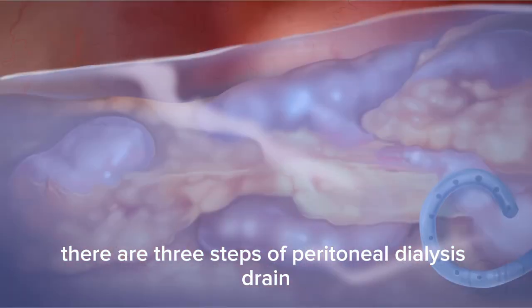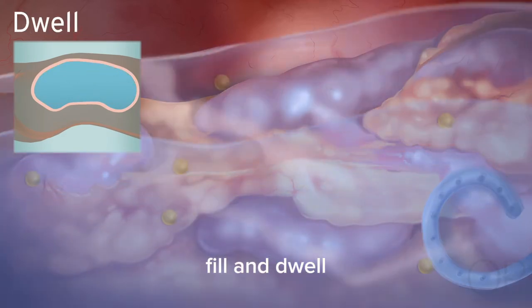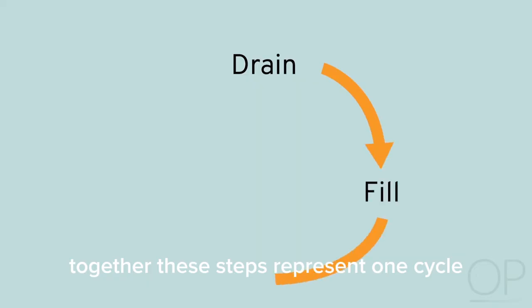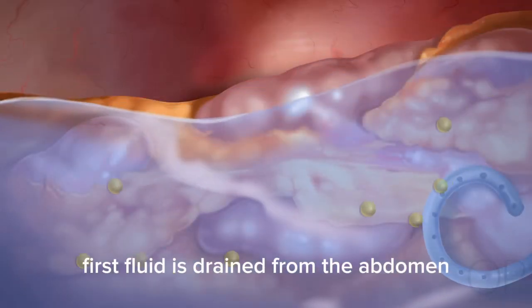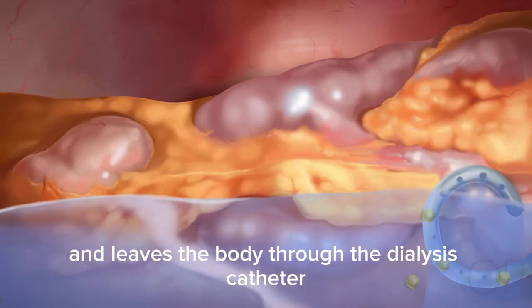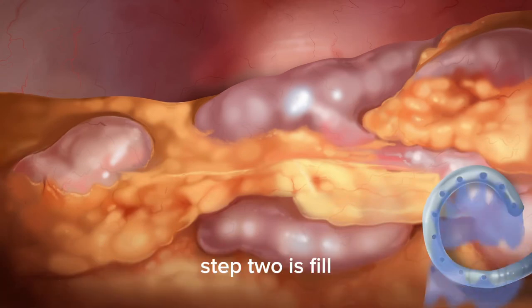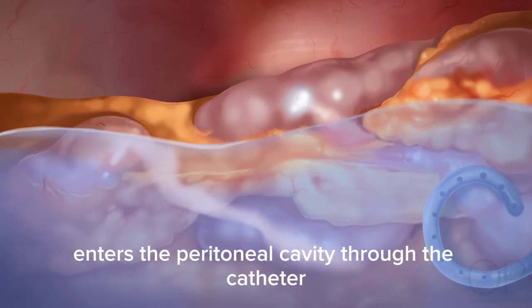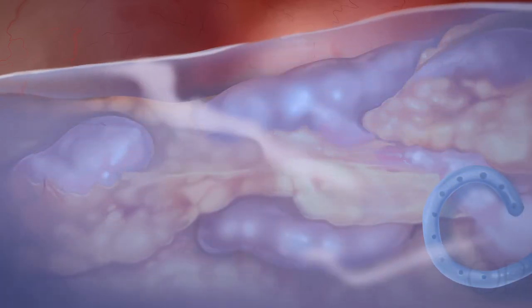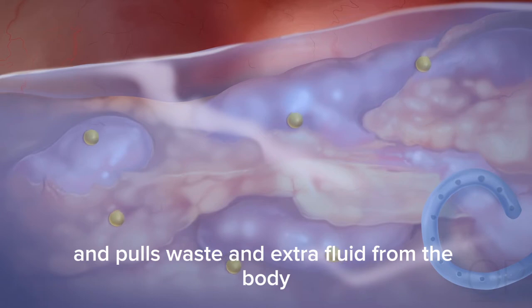There are 3 steps of peritoneal dialysis: drain, fill, and dwell. Together, these steps represent one cycle. First, fluid is drained from the abdomen and leaves the body through the dialysis catheter. It takes toxins out of the body with it. Step 2 is fill. A special sugary solution called dialysate enters the peritoneal cavity through the catheter. Step 3 is dwell. The dialysate solution sits in the abdomen and pulls waste and extra fluid from the body.